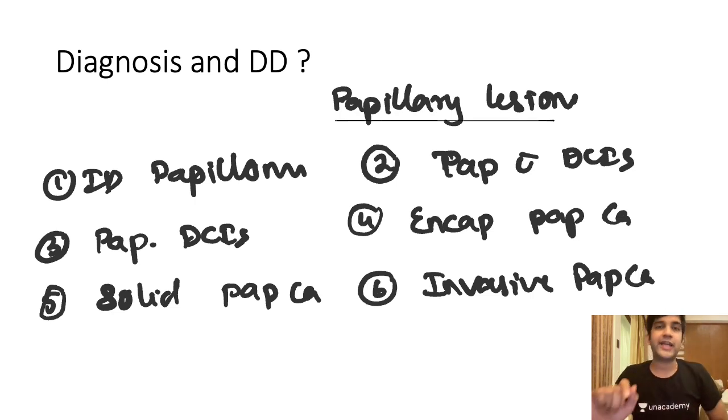Papillary lesions of the breast, I require IHC to further categorize them. Even if you're confident of a benign or a malignant lesion, I want you to do an IHC and then report it. It's not to say you are inferior in histomorphology, it's to have evidence for my diagnosis. I'll be perfectly correct with evidence, right?